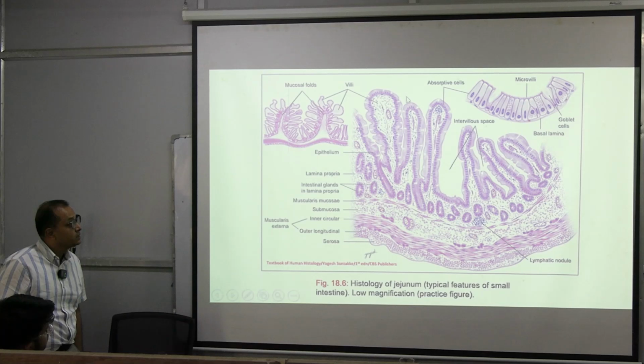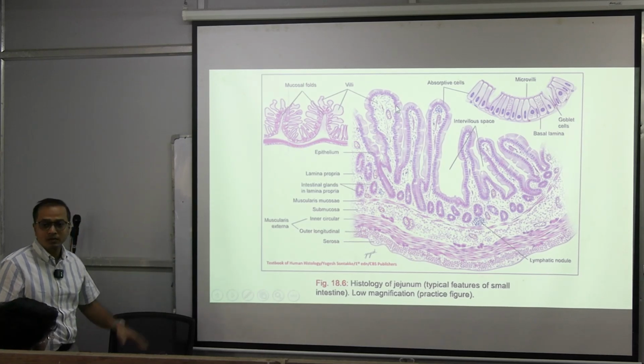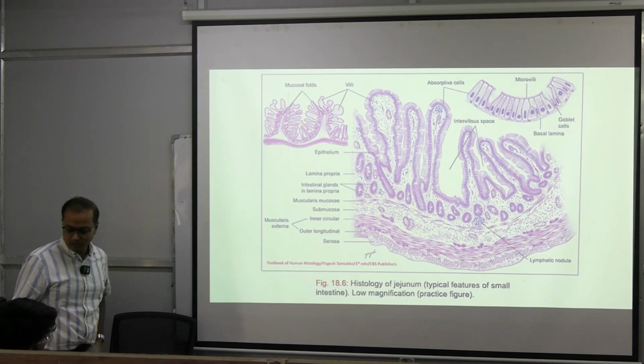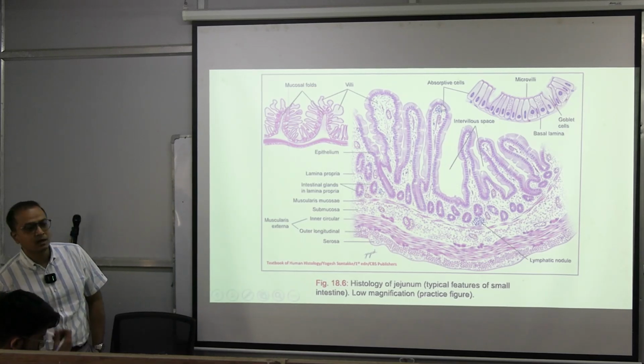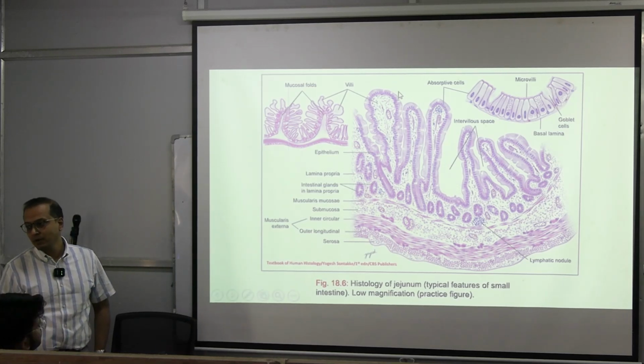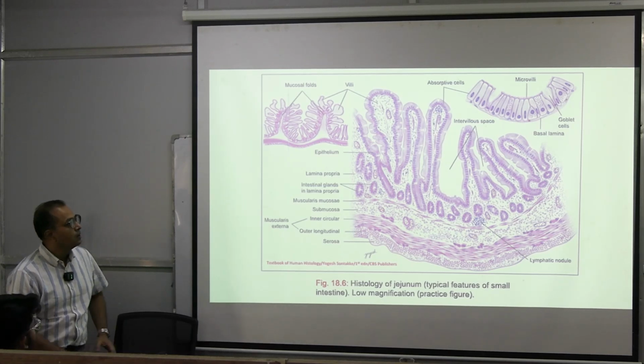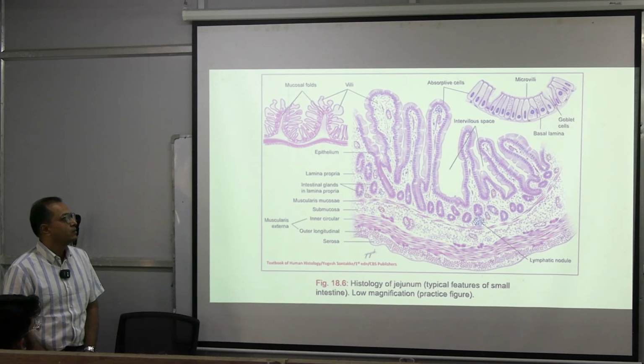In this region you see the mucosal epithelium which is spaced by these white dots. The further you go down the small intestine, from the duodenum to the ileum, the more random dots we see. These are goblet cells. They are interspersed among the mucosal cells; they are mucus secreting cells or glands present as goblet cells, spaced in between the mucosal cells.